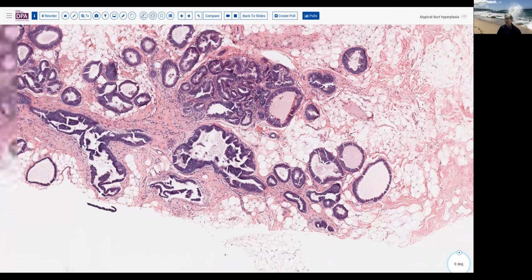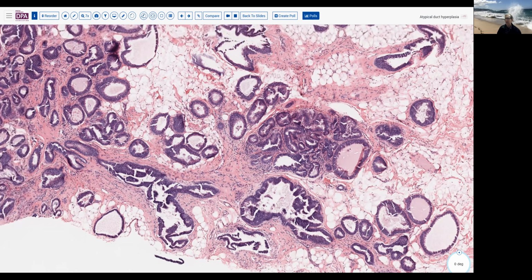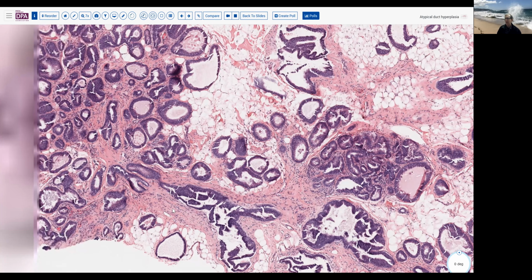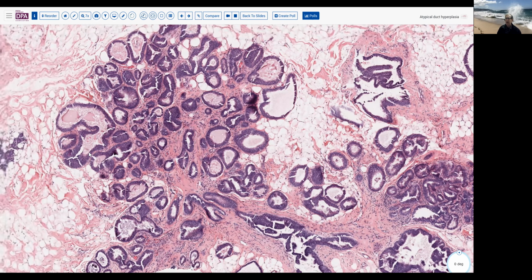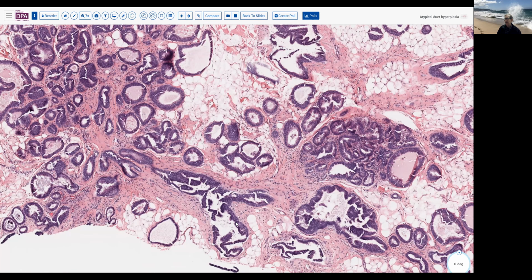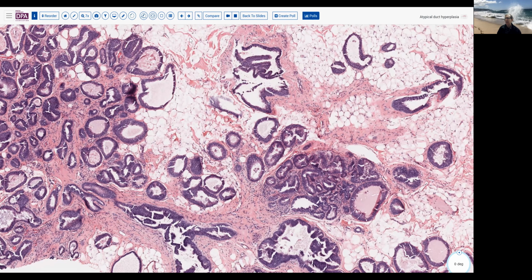So using the term atypical ductal hyperplasia in a setting like this is appropriate because it's not fitting into one of the well-defined ductal carcinoma in situ patterns, but we do have this columnar cell change with atypia, and we do have a little bit of atypical debris and some beginnings of a more solid appearance with this early tufting or papillarity into the lumen.